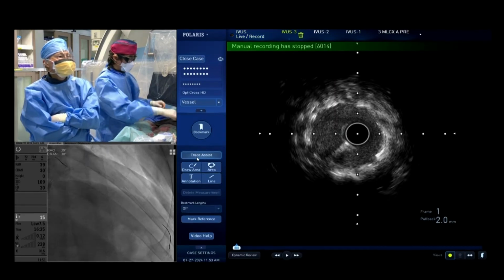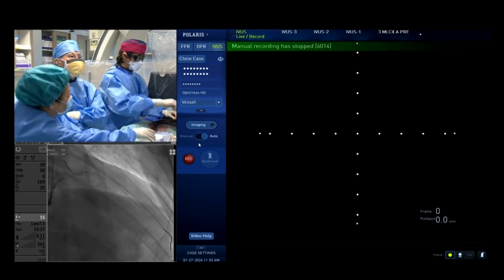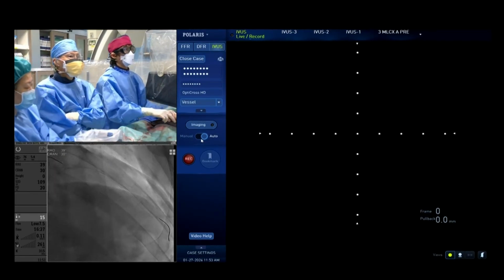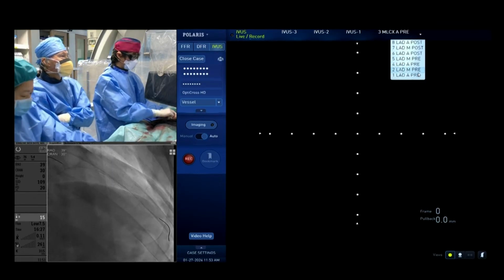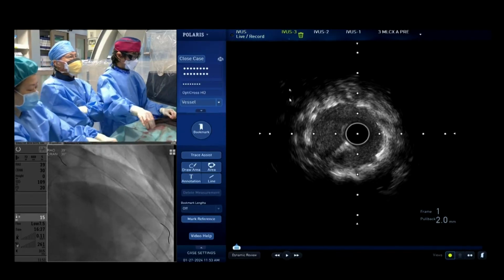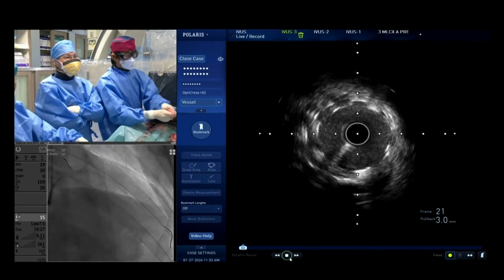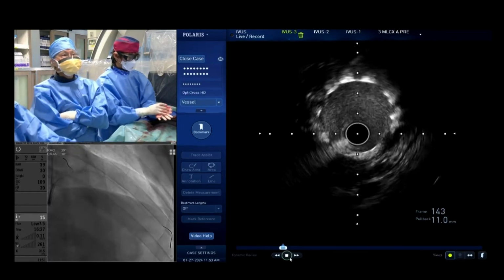IDU has a comment. Actually, I was thinking that there is some very proximal circumflex lesion, and you still need to do a kissing maybe before you're done. Actually, the ostium of the circ doesn't have any disease.